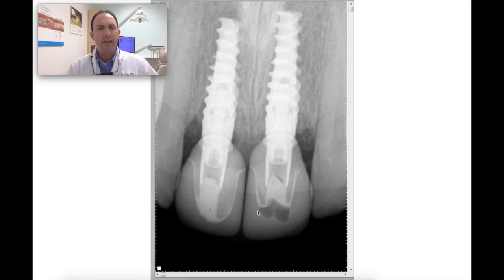So when he comes in for follow-up, I'll try to take a couple of post-op photos of the tissue. It looked really, really good on the lingual, though, because this one is slightly higher. You can see there was a little bit of a depression. The palatal tissue is nice and tight, and then there was a little bit of a depression right there where the abutment meets the gum tissue, just because of the positioning of where this emergence profile was. I couldn't get a really solid connection just because of how high that implant surgical platform was.